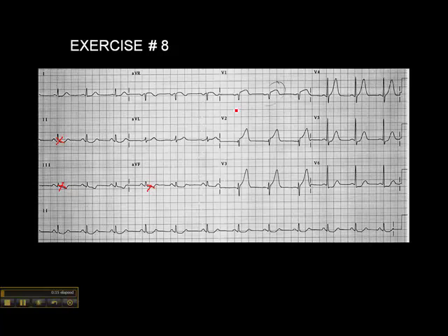When we look at the anteroseptal leads, we have ST elevation in V1, ST elevation in V2, and ST elevation in V3. But interestingly, we don't have ST elevation in V4.